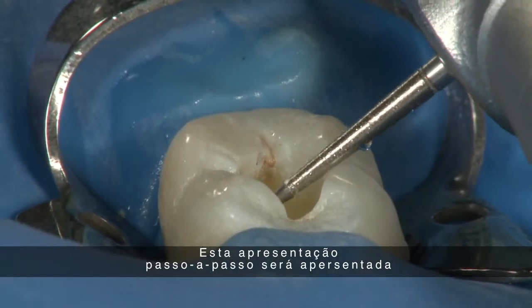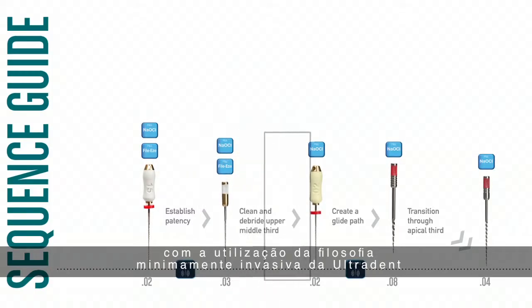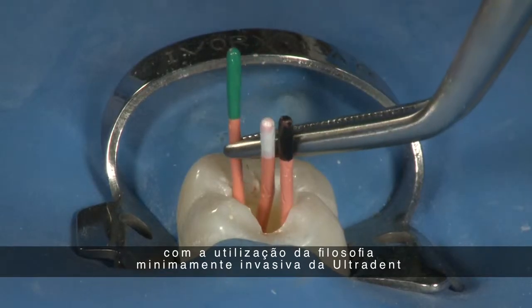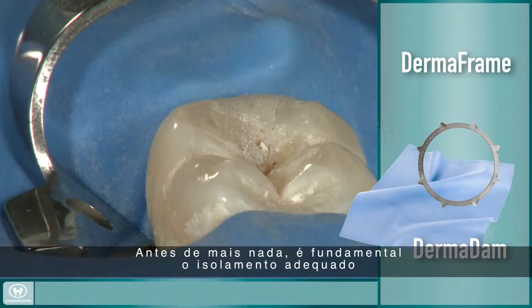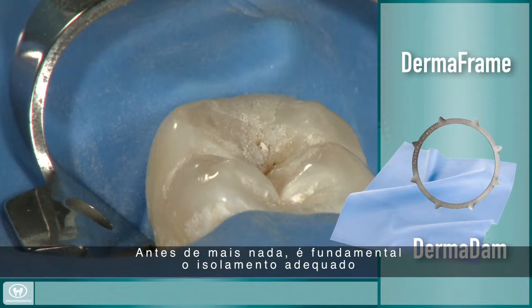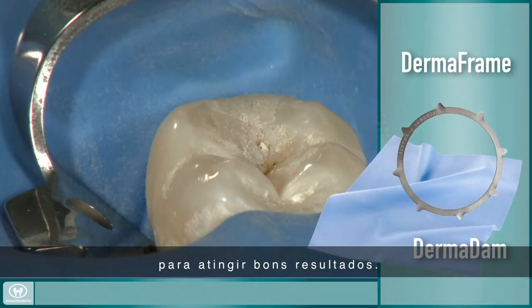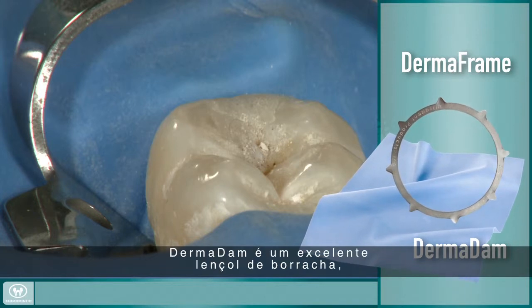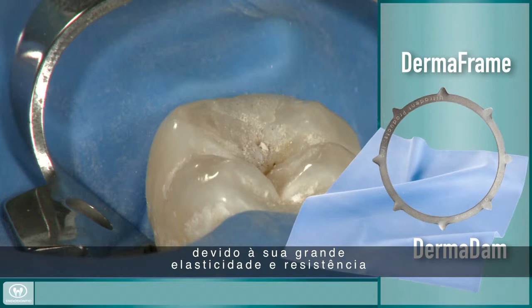This step-by-step presentation will provide you with a simulated common endodontic case utilizing Ultradent's minimally invasive philosophy and the Telos hybrid file system. First and foremost, proper isolation is essential in endodontic procedures to protect the patient and to achieve a good outcome. Dermadam provides an excellent barrier due to its high elasticity and strength.